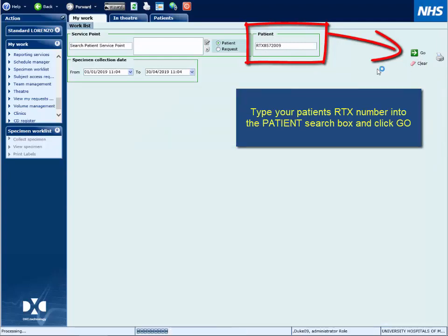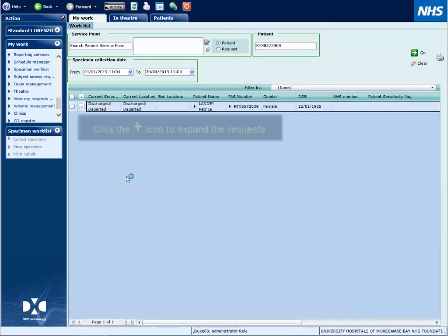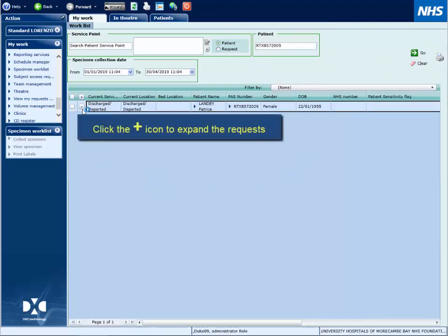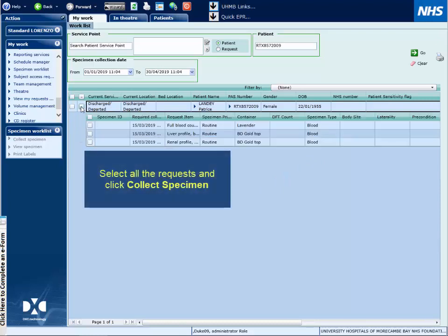To view pending specimens, press the plus icon. This will display all the placed requests.